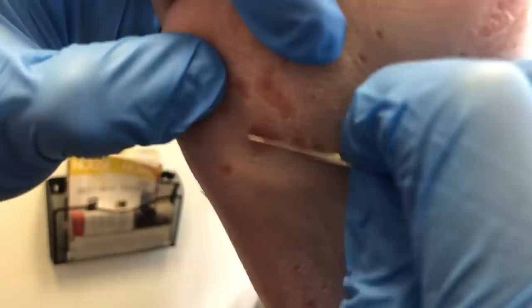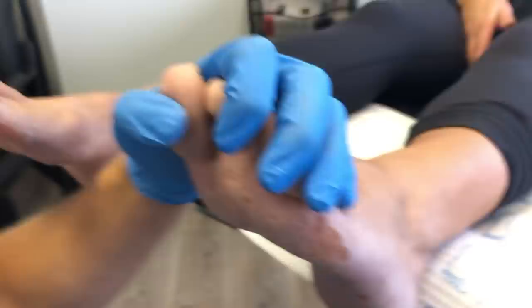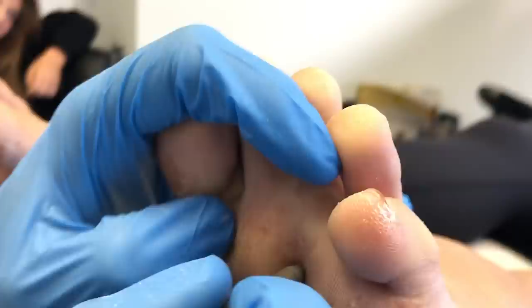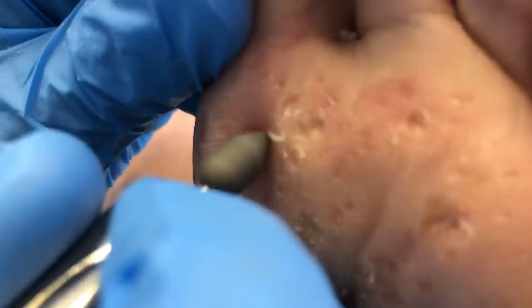I just ran my thumb over it to feel how rigid it is and to feel the ridge around the callus, making sure it's extra smooth for the patient so they're not getting so much pressure when walking. Now I'm using the end of the burr to clean up some of those corns. You have to be careful because after the burr has been running for a long time the tip gets quite hot, so I'm jumping around — holding it briefly then moving — to prevent it from heating up and causing a burning sensation for the patient.